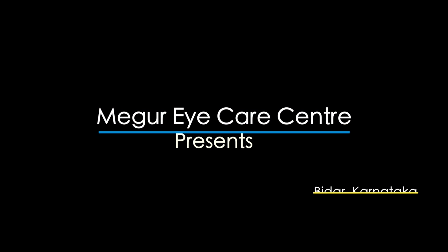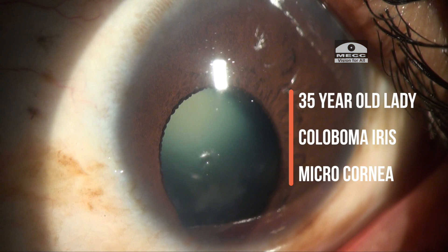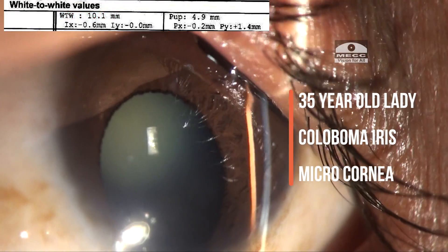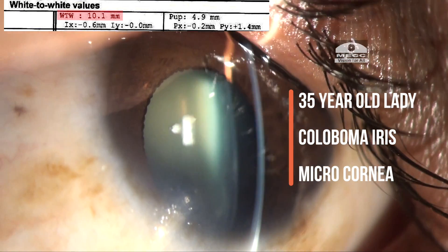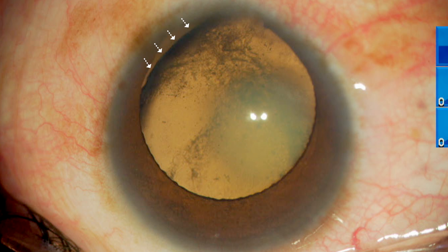Hello friends, this is Dr. Deepak Megur, and I'm here with another interesting case of a one-eyed young lady who has a posterior subcapsular cataract with coloboma of the iris and a small cornea. On retroillumination on the table, we can see two to three o'clock hours of zonular dehiscence.